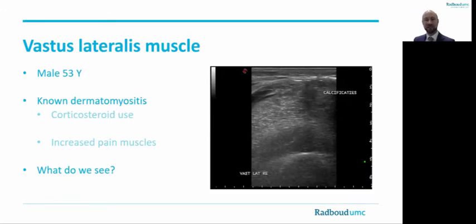Here we see an ultrasound image of the vastus lateralis muscle of a 53-year-old patient known with dermatomyositis, who has been using corticosteroids since 2010. He experienced increased pain in his legs. We see high echo intensity of the muscle with loss of normal muscle structure and some calcifications — both findings expected in dermatomyositis. But we also see a rather hypoechoic layer lying between the fascia and muscle. A full-thickness biopsy including this hypoechoic layer revealed a disseminated Mycobacterium avium infection, most likely triggered by the immune suppression. Quite an impressive case.